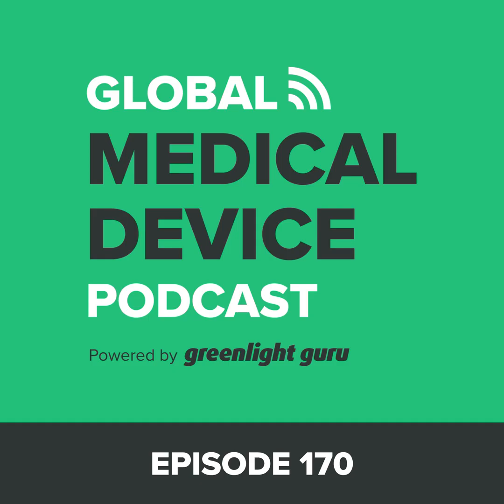Because I guess for those who aren't familiar, the verification and validation for a software-only device is a major undertaking. This is something that can potentially take weeks to months to complete. It's a huge part of the final QMS system for a software-only device, and so you don't necessarily have to have it coming into the first interaction with the FDA, but it's something you need to be thinking about for your company's projected timeline as a whole.